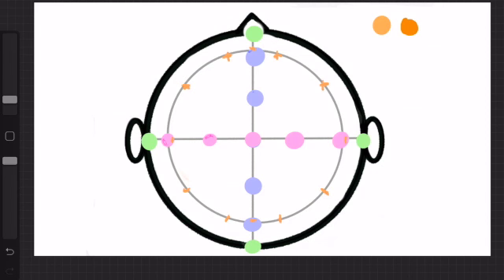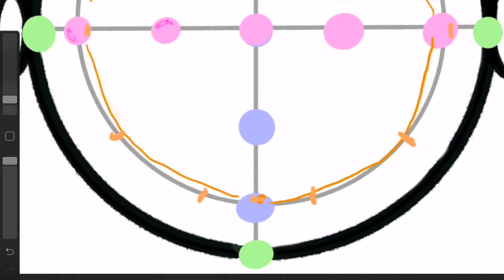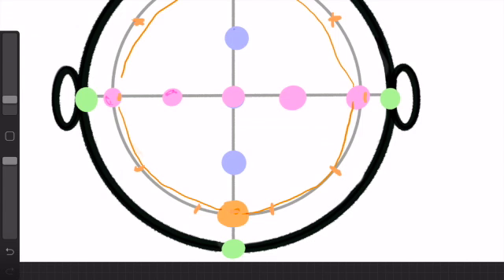The third section of measurements is the circumference. So getting right into it, we're going to find the true OZ. You're going to measure the circumference of the head at 10% points and divide the total distance by 2. What I mean by 10% points is we're just going to pass through the pink and light blue points and not the green points. And the total circumference I got was 63.5.